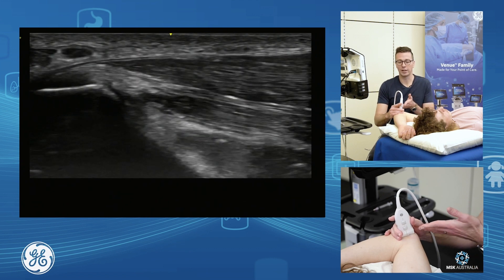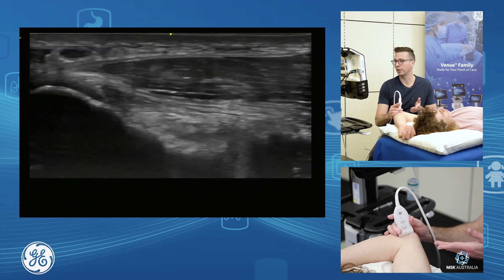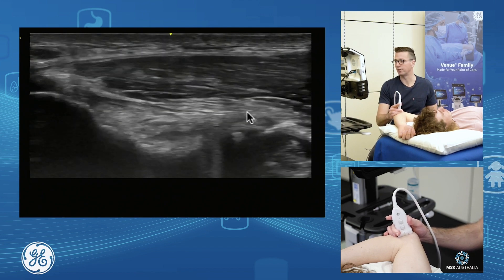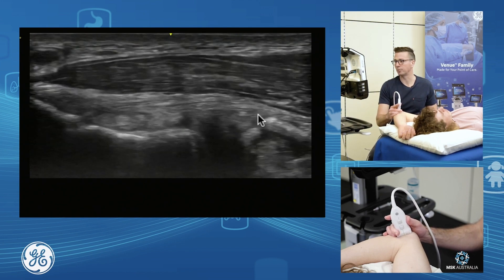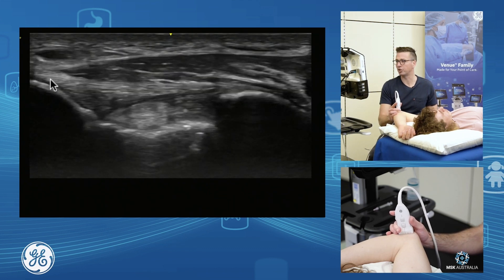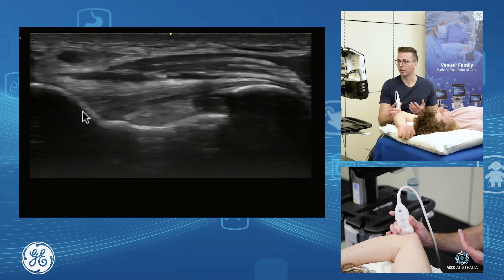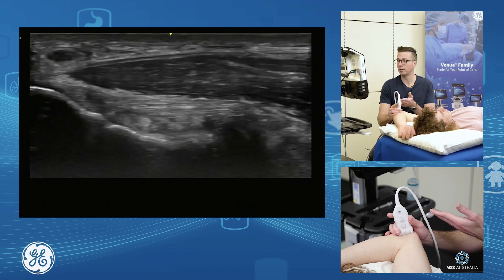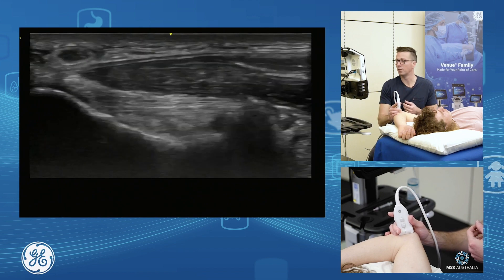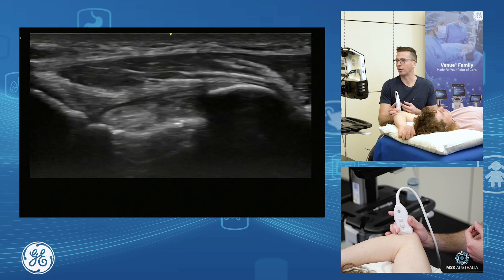From here, if I keep this end of my probe anchored and rotate the other end towards the patient's little finger, I come down more towards the ulnar collateral ligament — the anterior band of the ulnar collateral ligament — which is this fan- or sail-shaped structure inserting onto the sublime tubercle. Probe towards the little finger gives the UCL; probe towards the thumb gives the common flexor.